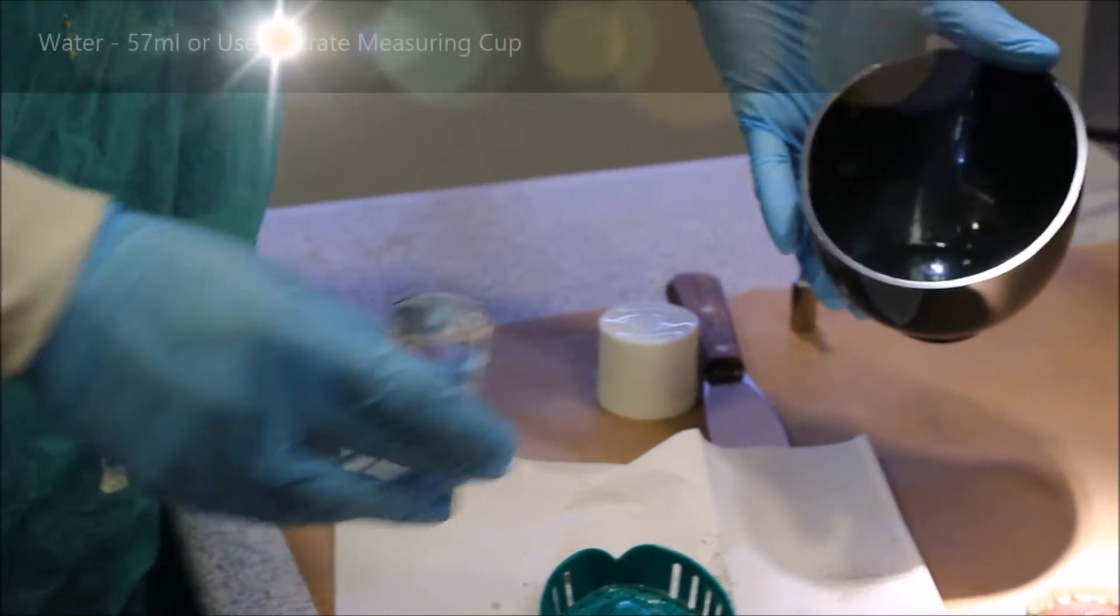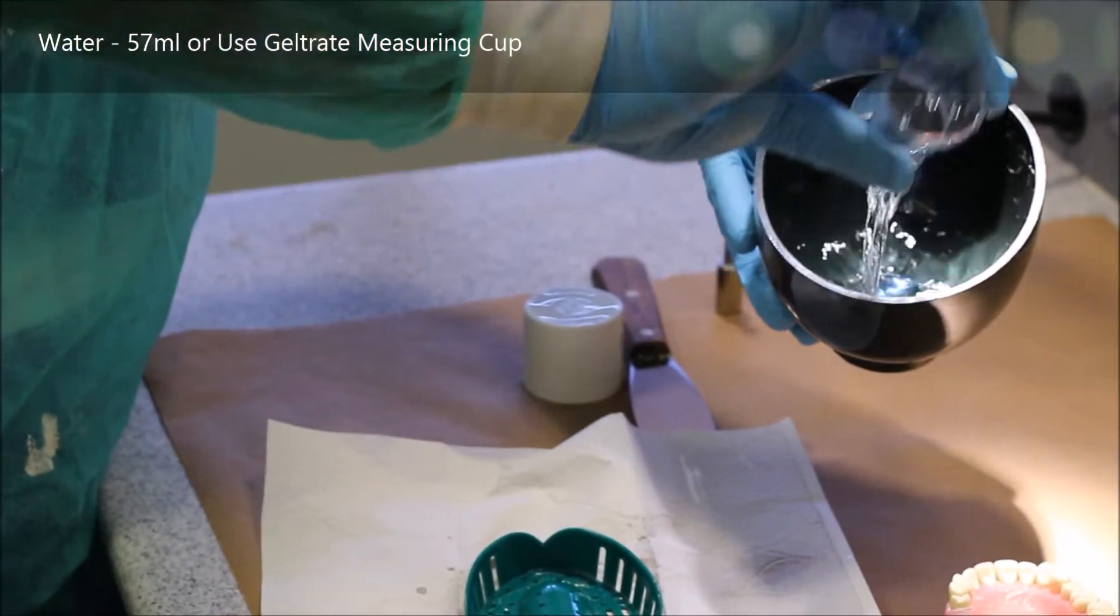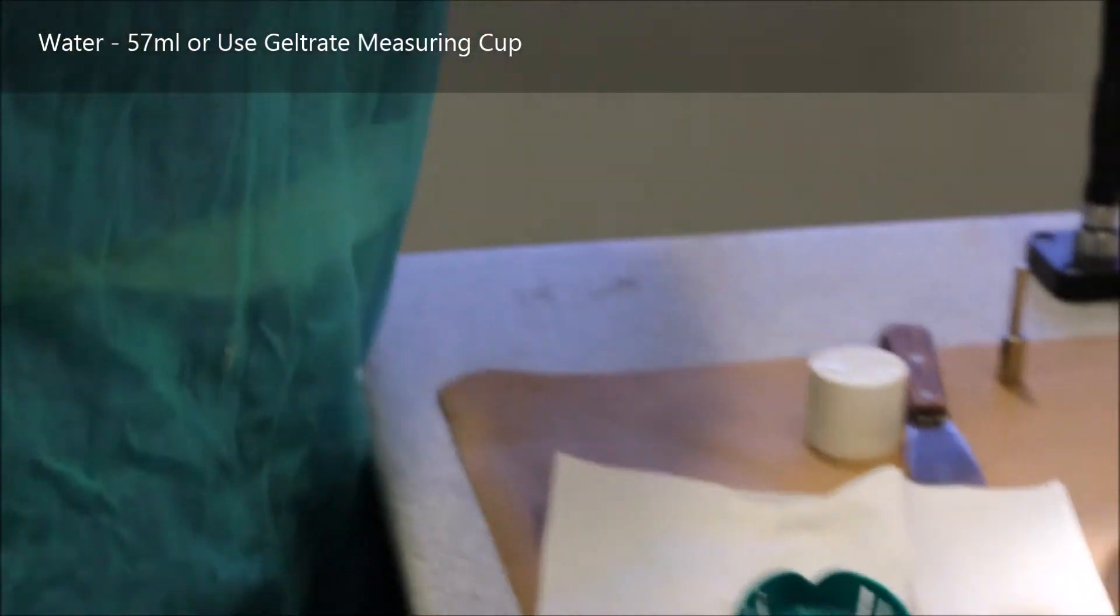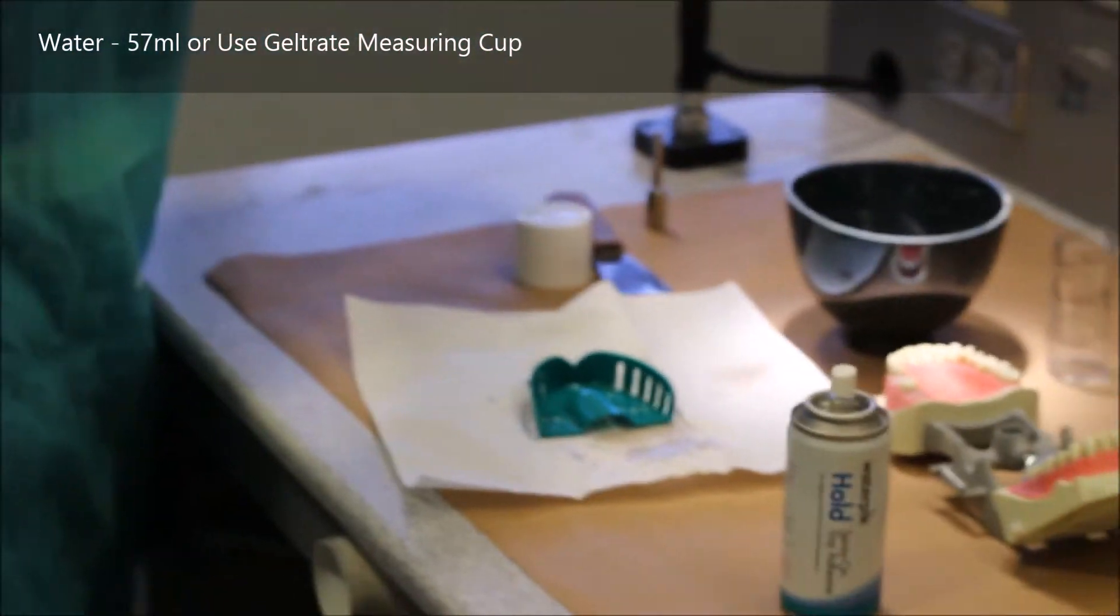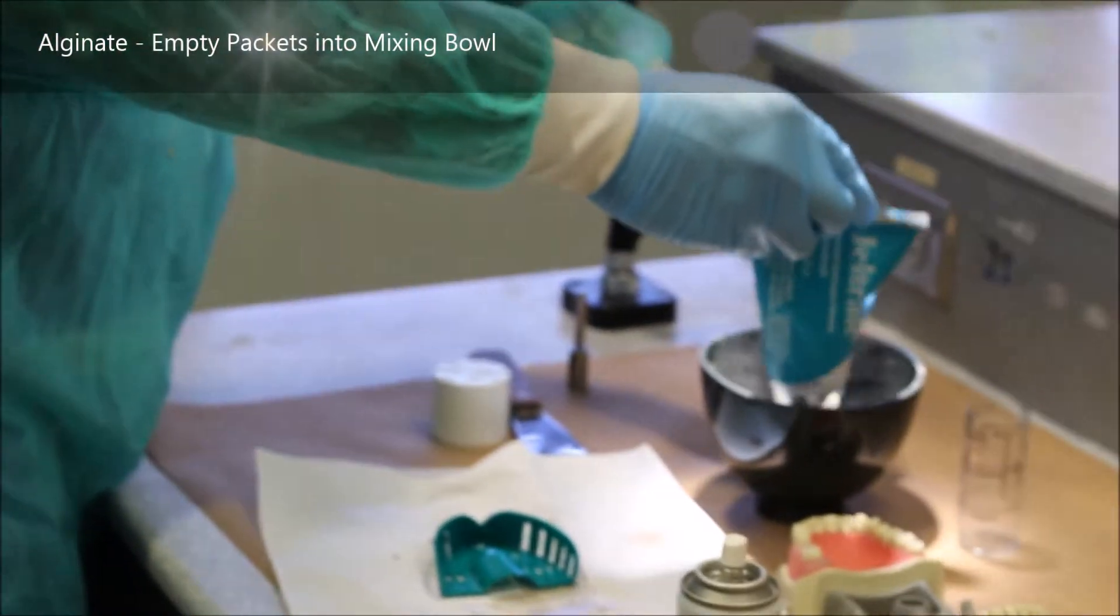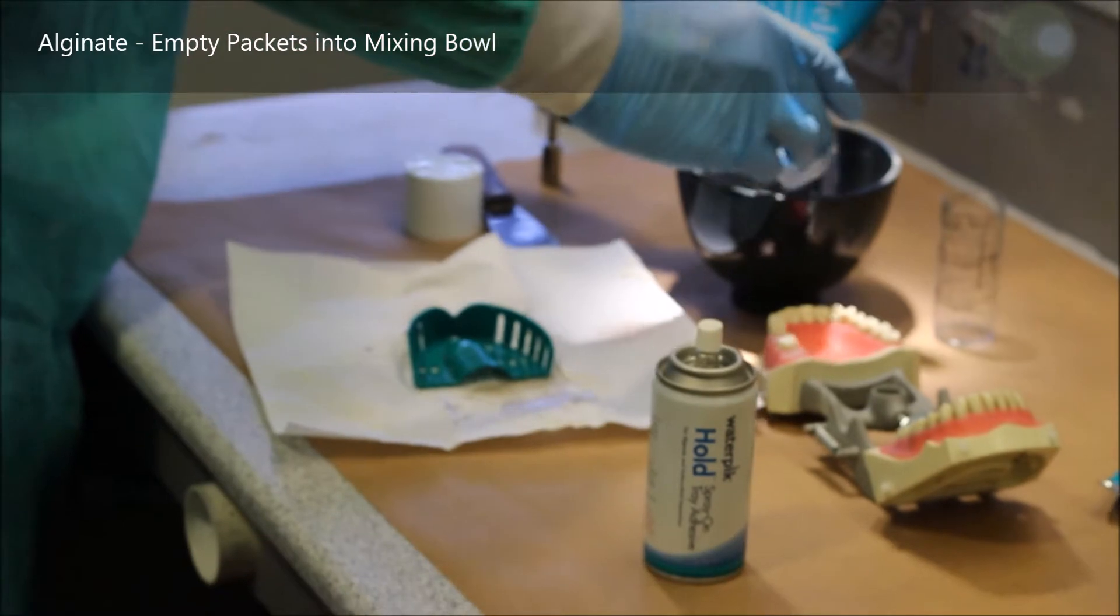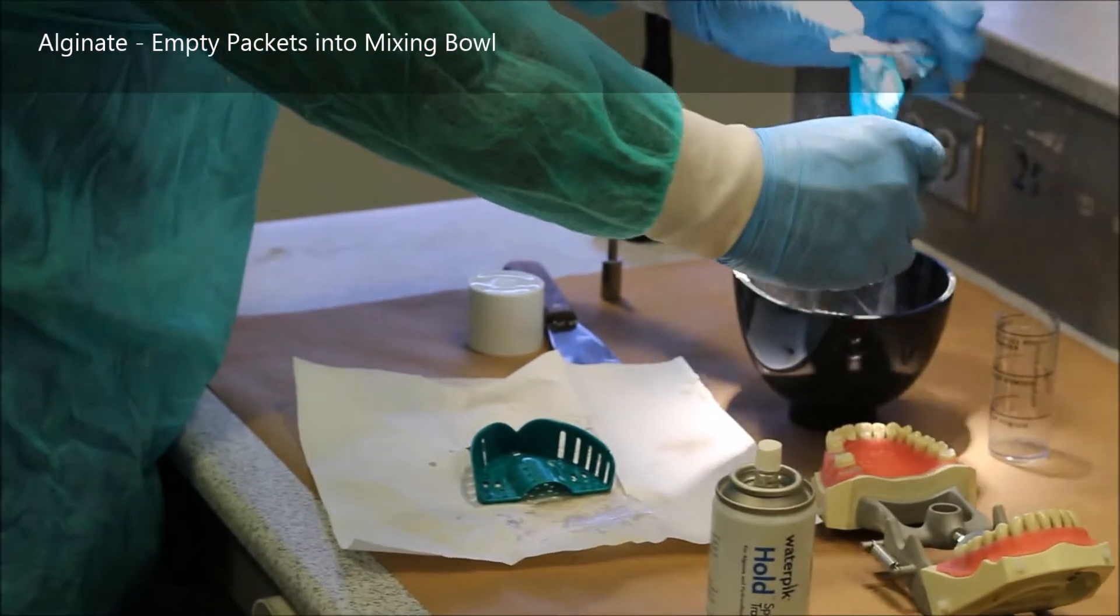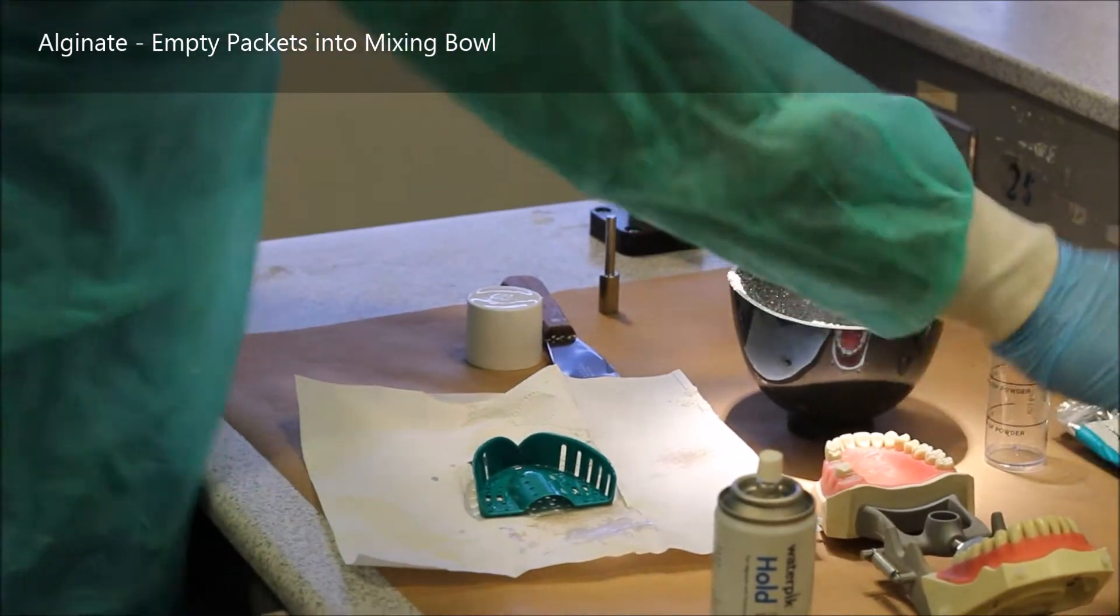At this point, you want to take the water that's pre-measured. Here I'm using two packets of alginate because it's the maxilla. You take both measures of water and place them in your mixing bowl. Then you grab your two packets of alginate and carefully empty out the powder into the mixing bowl. You always place water before you place the powder.